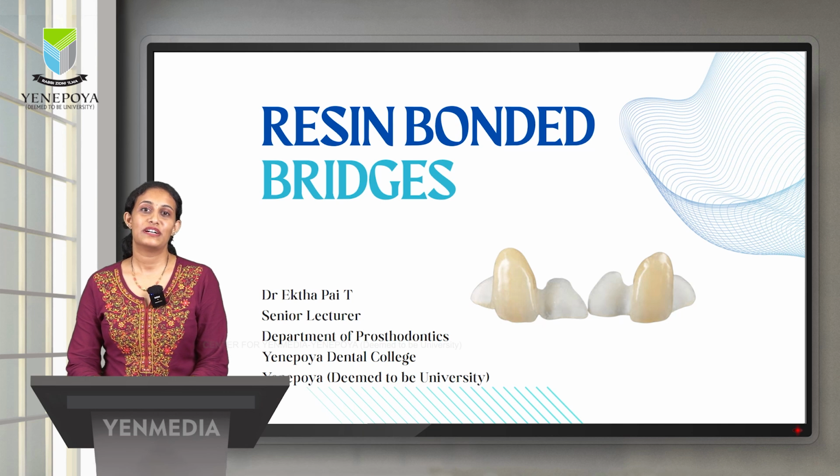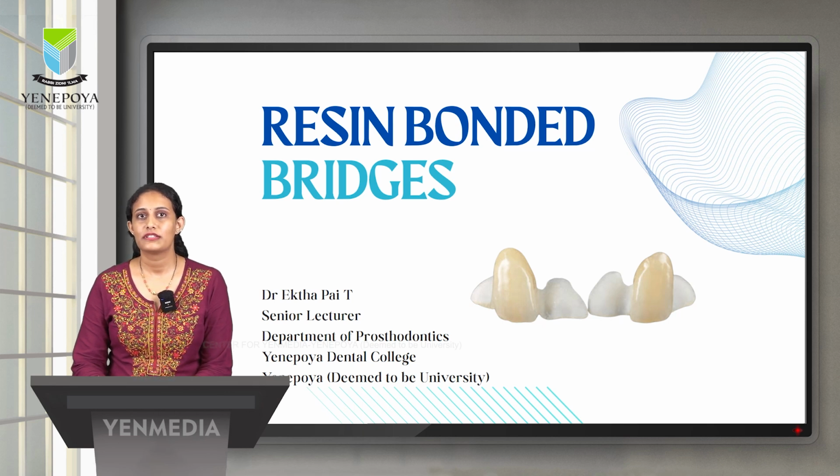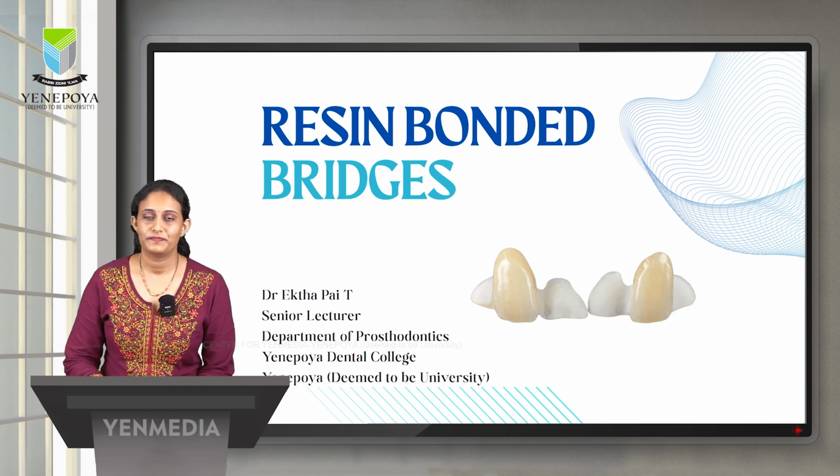Now when we hear the term resin bonded bridges, we obviously imagine the resin cements and the composites or a provisional restoration. But let me tell you, we can use this as a permanent prosthesis as well.